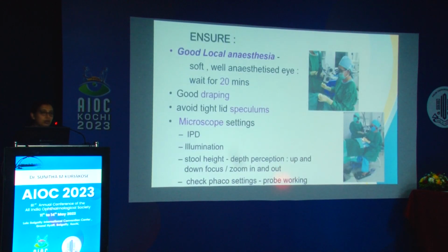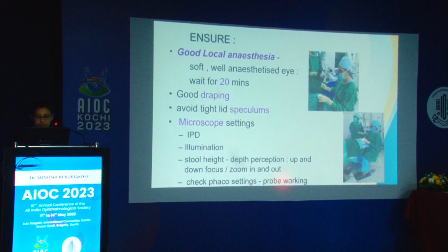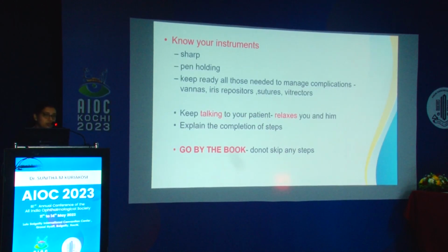Always ensure a good local anesthesia. A well anesthetized, soft eye is very important for a good surgery. So always wait for 20 minutes after you have given your block. A good drape should be put. Avoid tight lid speculums. The microscope settings, as already explained, should be checked beforehand itself. You should know your IPD very well. Know your instruments well, whether they are sharp, how to hold them, and keep ready all those needed to manage any complication that occurs, like your vannas, iris repositors, sutures, vitrectors.